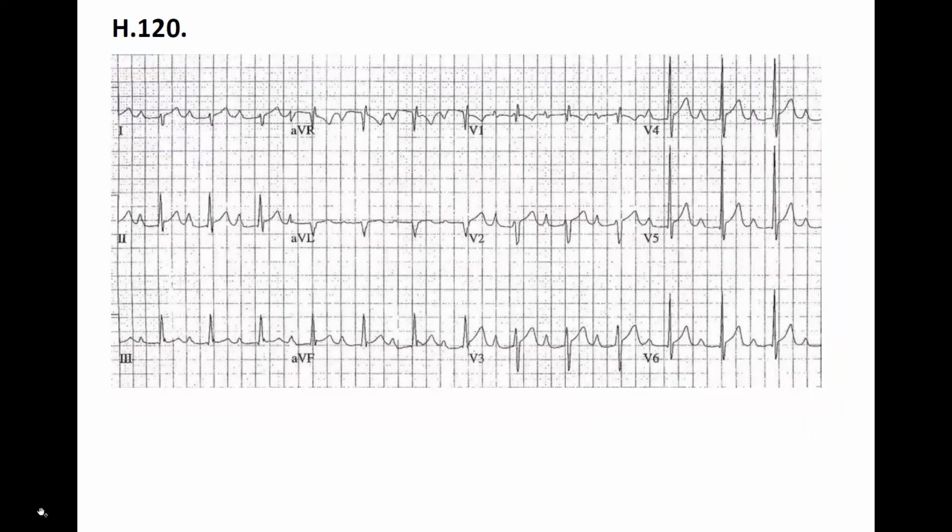Well, I can say this is rhythmic too. The heartbeat is less than 4 blocks, but more than 3. So that can be around 80, or you could say 90. As before, I think maybe Sebastian or Miro said it, between 75 and 100 beats per minute.